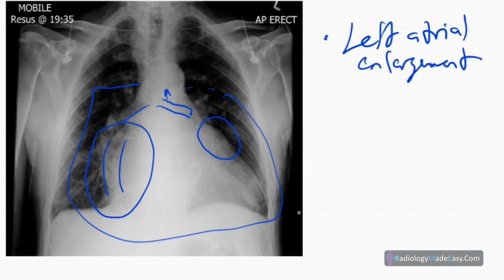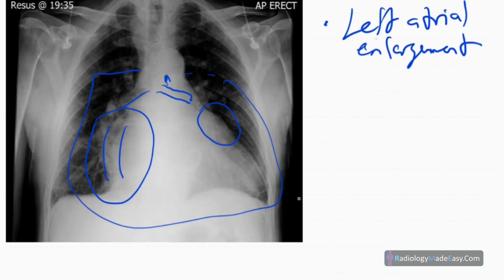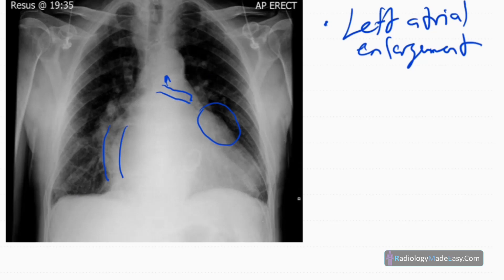So the findings indicate left atrial enlargement and mitral valve replacement. In the perihilar region you can see some abnormalities — an early 'bat-wing' appearance — and engorgement of pulmonary vessels can be seen in the hilar region.